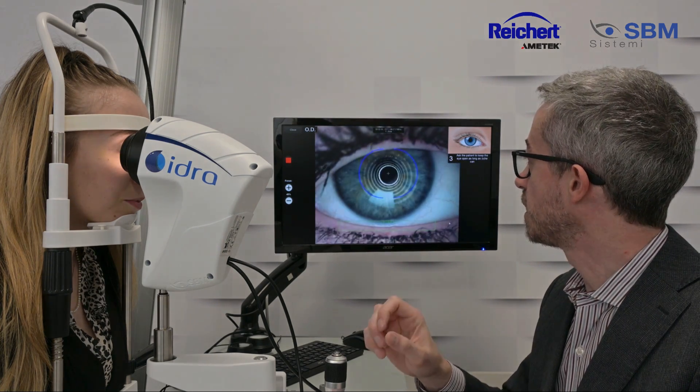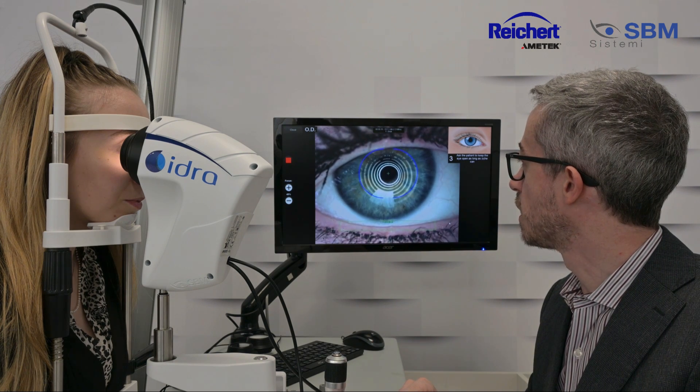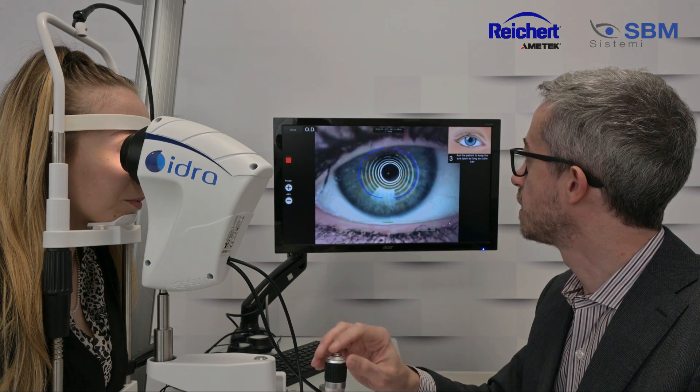Double blink, keep the eye open, keep the eye open, try not to close, try not to close until you can.